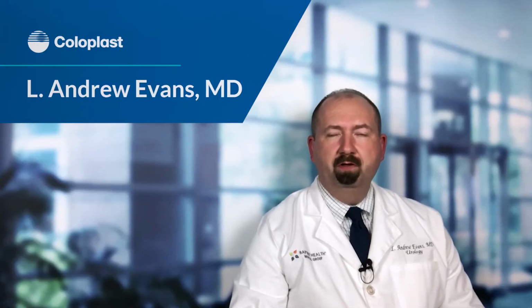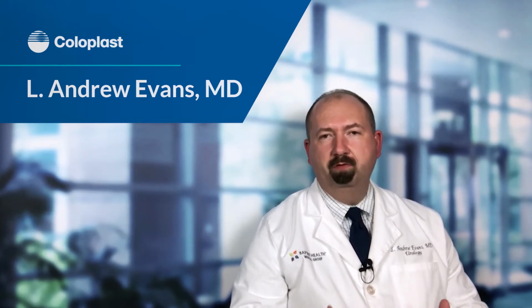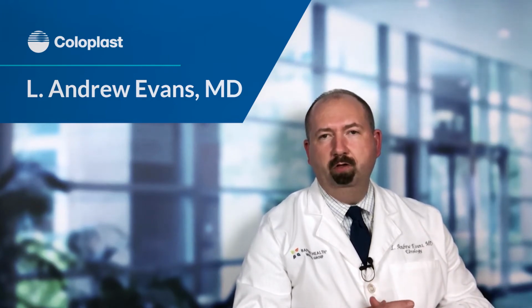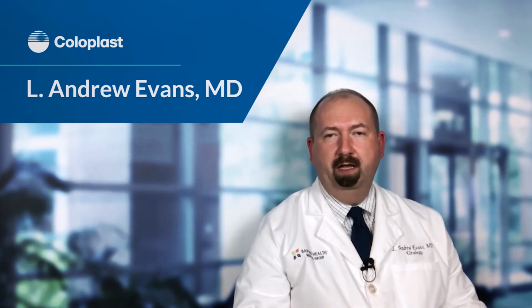There are a couple of different types of male slings available in the United States. Both of these slings are obturator male slings that apply pressure on the urethra to elevate the urethra and restore that support. Coloplast makes the Virtue male sling, and AMS makes an Advance male sling.